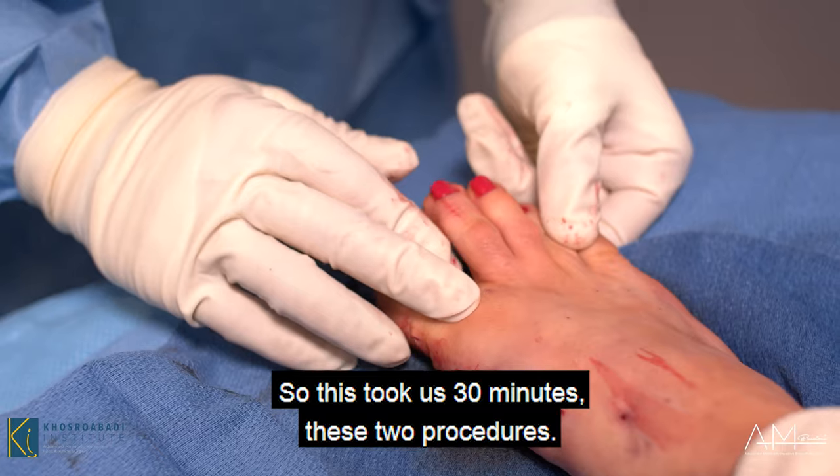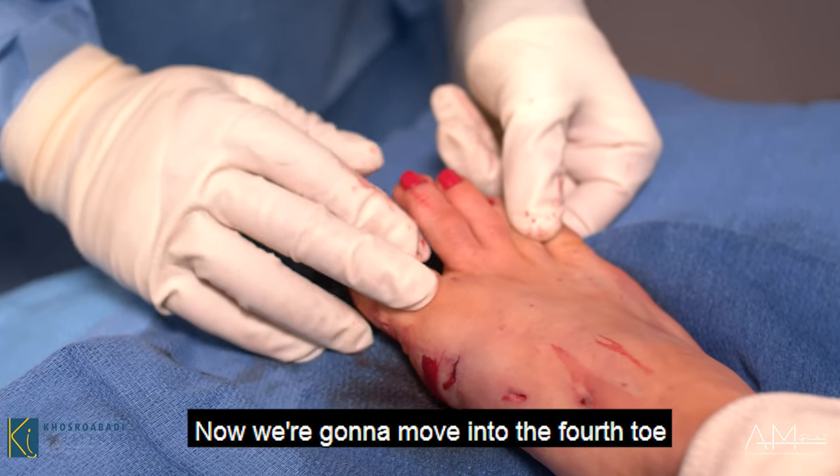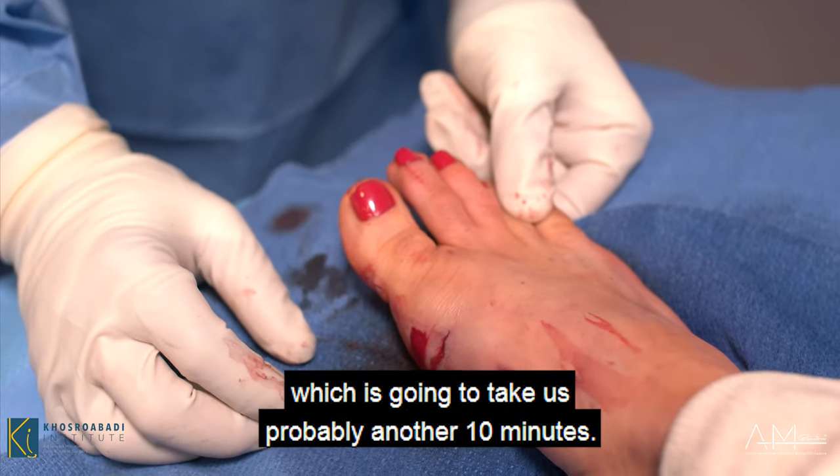We're going to move to the third part of the procedure, which is the hammer toe, so stay tuned for that. These two procedures took us 30 minutes. Now we're moving to the fourth toe, which will probably take another 10 minutes.